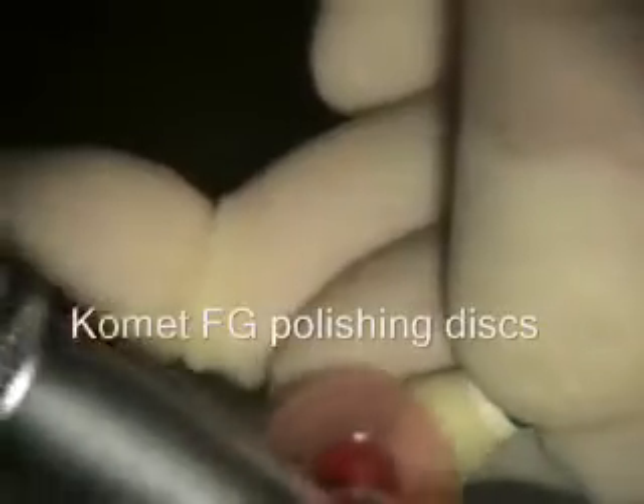Now we're doing the backfill — what I call the backfill. We're polishing our crown now. I got the occlusion adjusted and I got the shape of the gingival part adjusted.